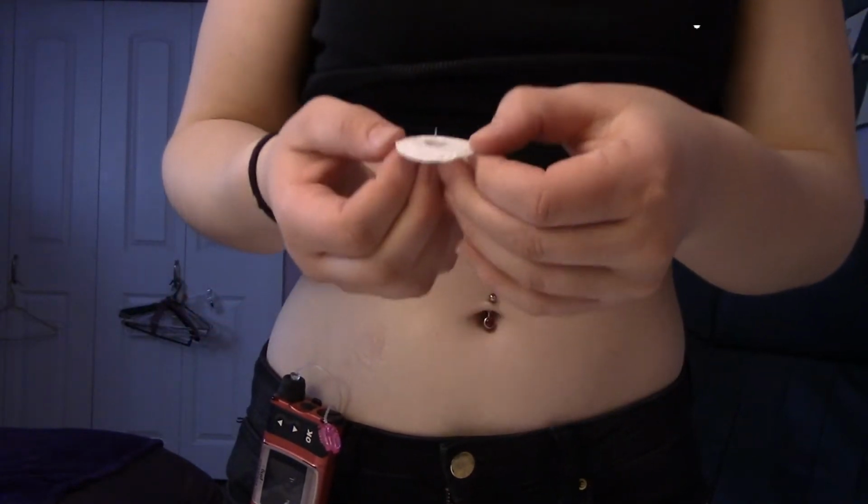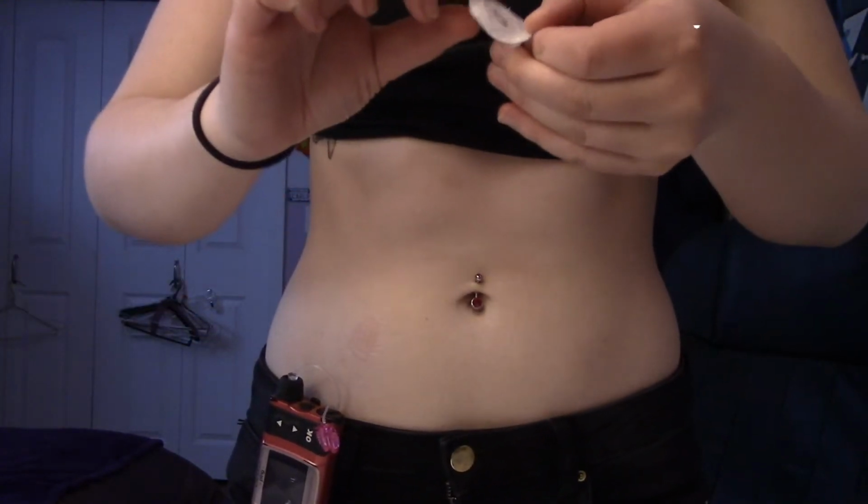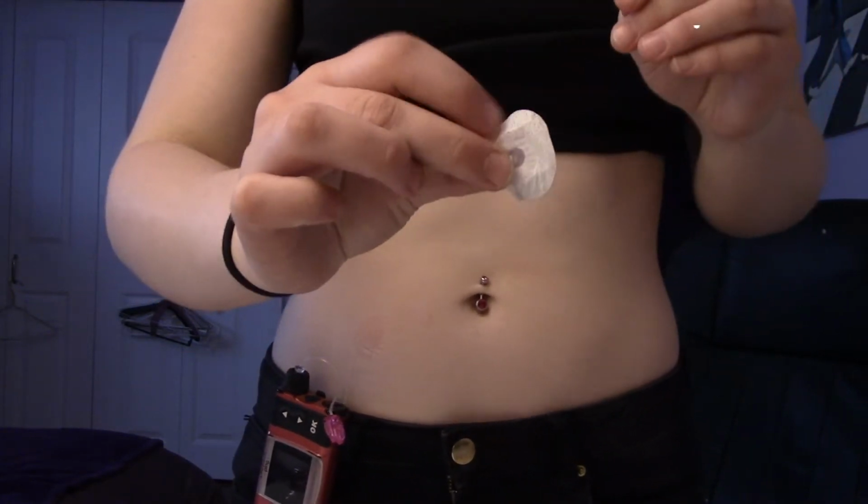Super easy, just like peeling off a band-aid. It's never hurt me before, but depends on what your pain tolerance is like. It really shouldn't hurt though. I'm gonna put this in my sharp spot.